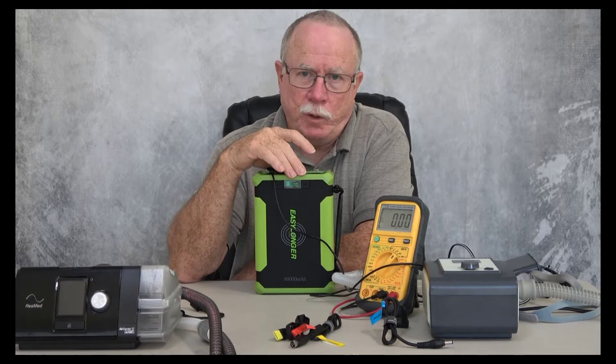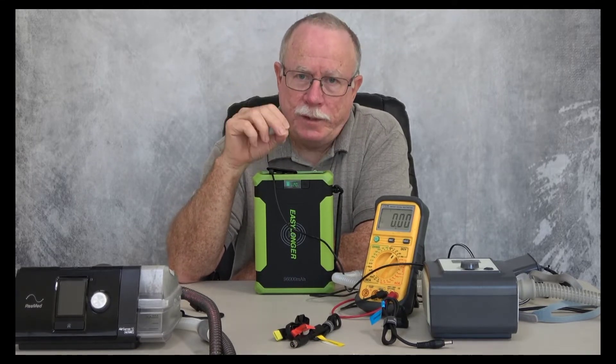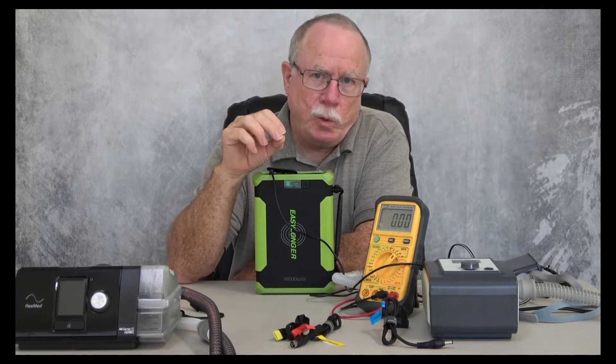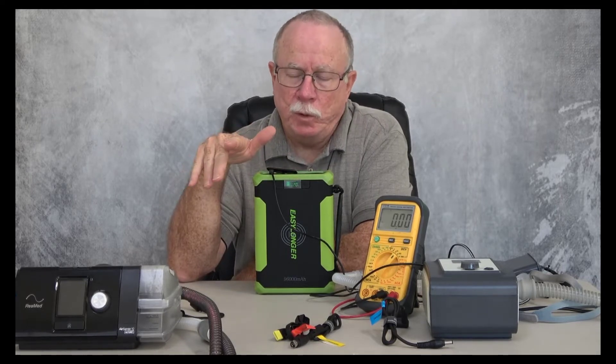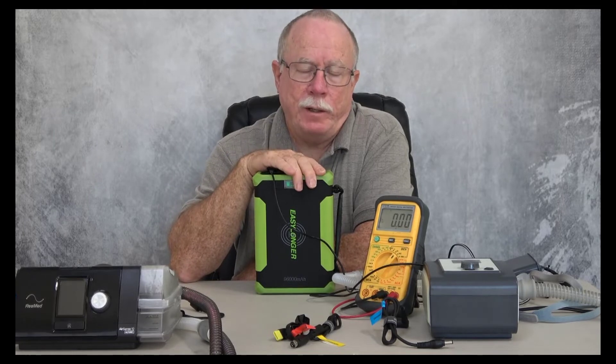There are four voltage settings: 12 volts, 16.5 volts, 20 volts, and 24 volts. So if your machine uses any one of those voltages, you should be able to power it with this battery.